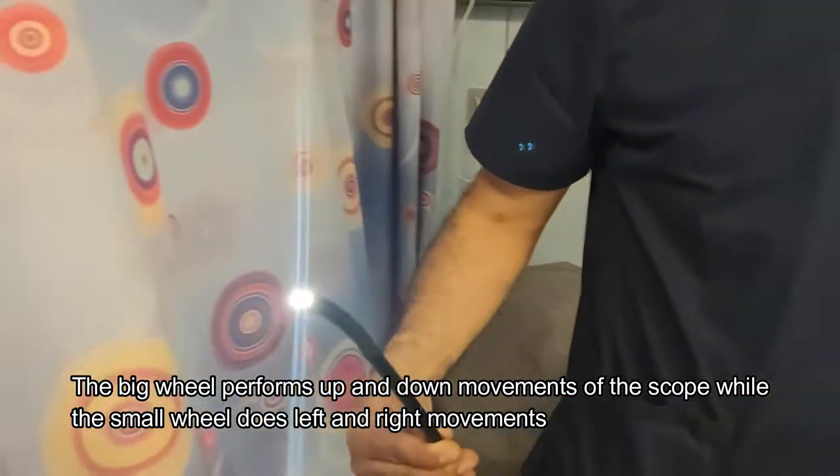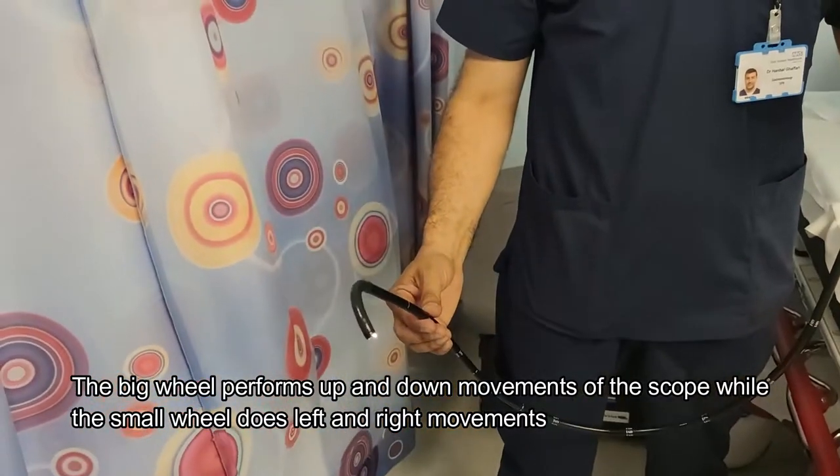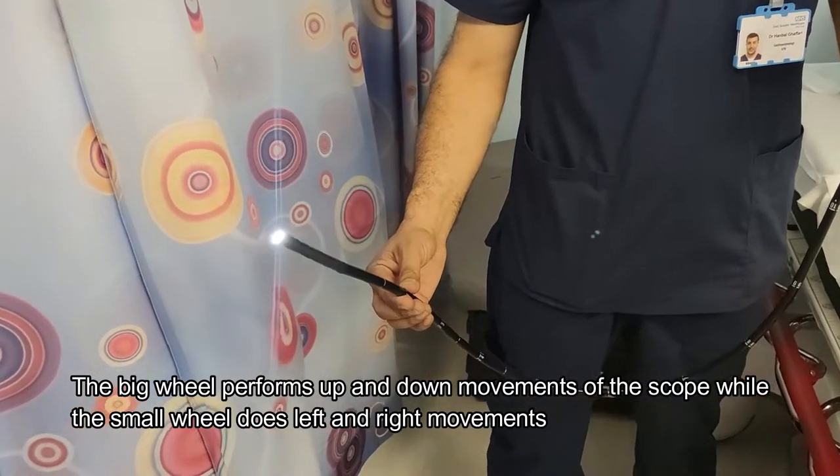The big wheel, as Dr. Havari will show us, controls the scope's movement going up and down. That's Dr. Havari pulling down on the wheel, and that's him going in the opposite direction.